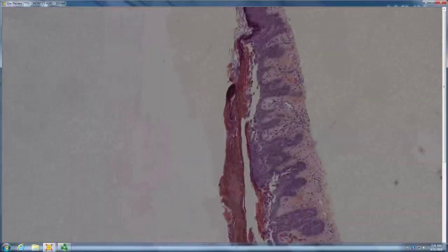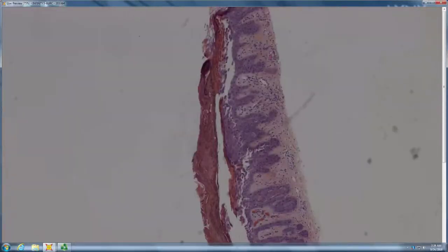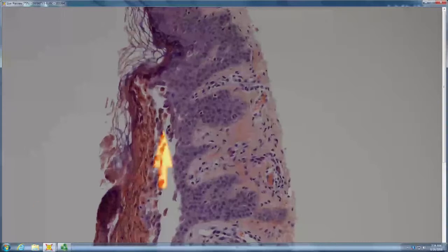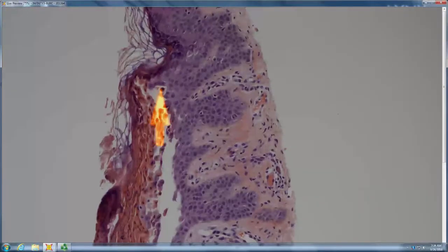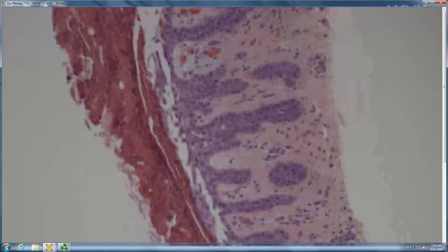Crusty over here. Looks like maybe in the granular layer there's some separation. Maybe some dyskeratosis as well. There's definitely dyskeratosis here, right? So you have corps ronds. Yeah. So it could be Darier's or Grover's again. Yeah, Darier's, Grover's, vulvocrural dyskeratosis, any of the ones that will give you a Grover's-like pattern.